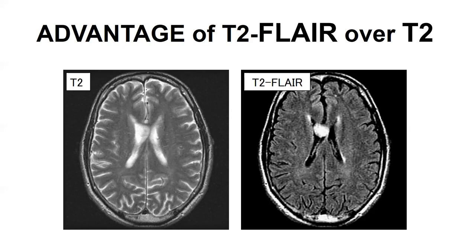All right? Many times, I'll just throw this in as a little caveat, oftentimes a T2 can actually be superior to T2 FLAIR in the spinal cord for imaging, and perhaps in our integrative diagnostic medicine case conference that I run every Friday, we will talk about that in a future conference. And in this series of Neuroimaging 101 for the pathologist, I'll cover that at one point.